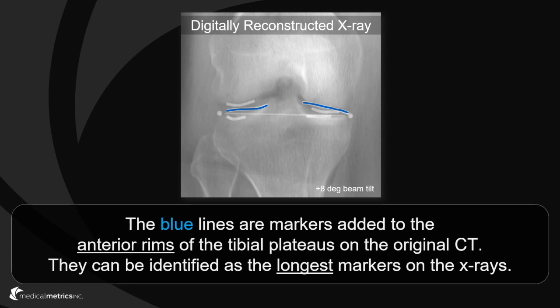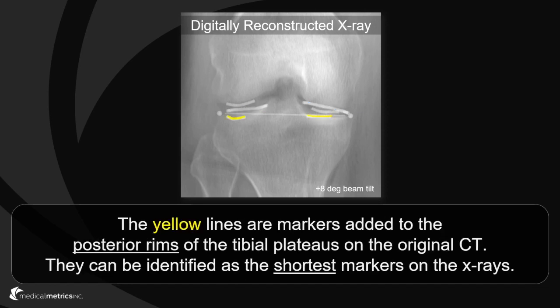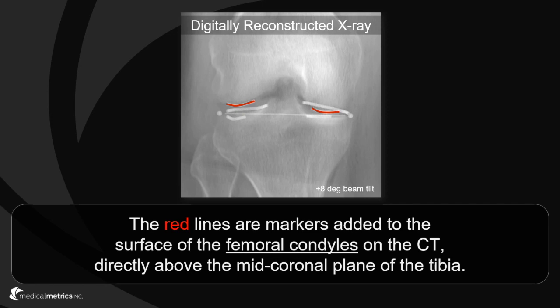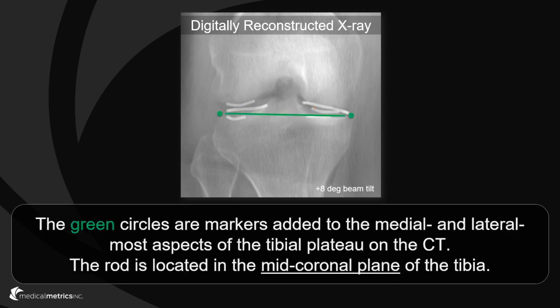The blue lines highlight the markers added to the anterior rims of the tibial plateau; they can be identified as the longest markers on the radiographs. The yellow lines highlight the markers added to the posterior rims of the tibial plateau; they can be identified as the shortest markers on the radiographs. The red lines highlight the markers added to the surfaces of the medial and lateral femoral condyles directly above the mid-coronal plane of the tibia. The green circles highlight the markers added to the medial and lateral most aspects of the tibial plateau.